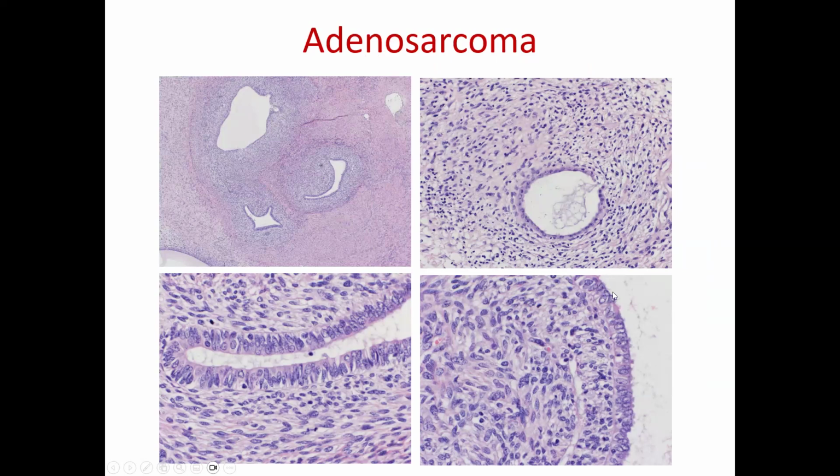They have some ciliated metaplasia, but the stroma is very busy, and then you start to see mitosis in the stroma. From low power, you see this phenomenon of cuffing, where the stroma is condensed about abnormal, phyllodes-like glandular arrangement. So this is the phyllodes counterpart of the cervix.